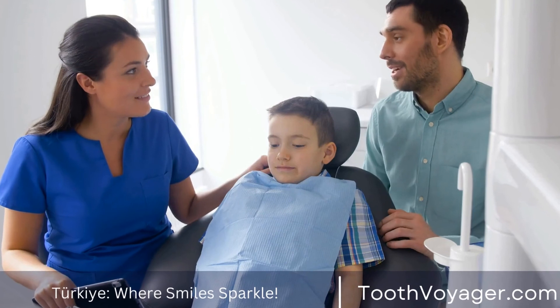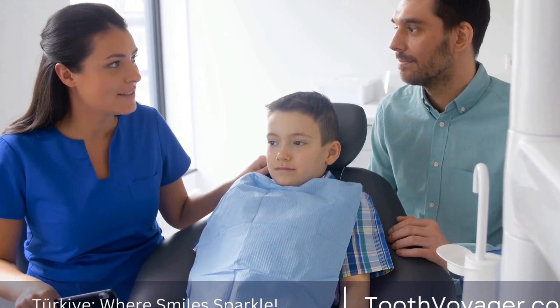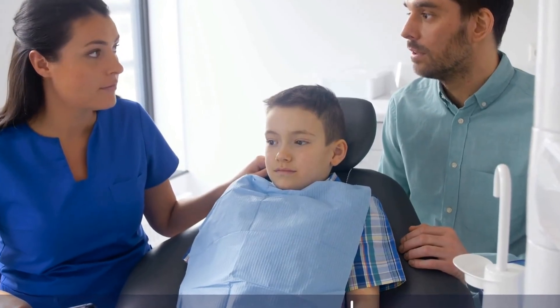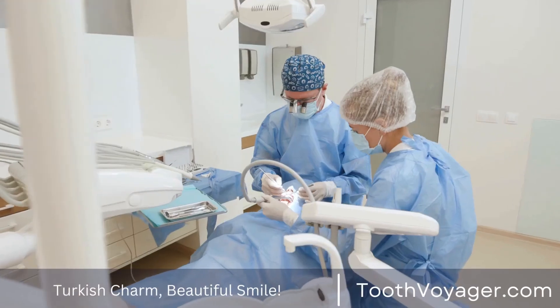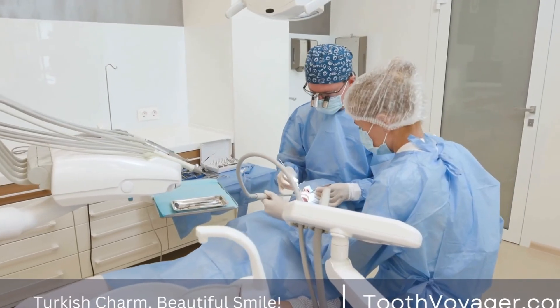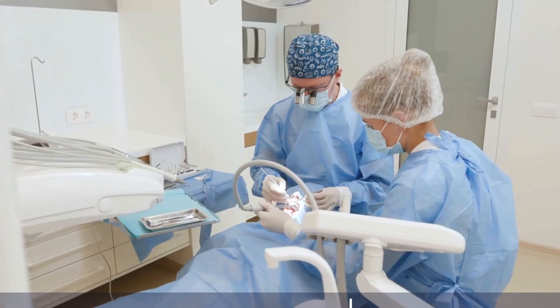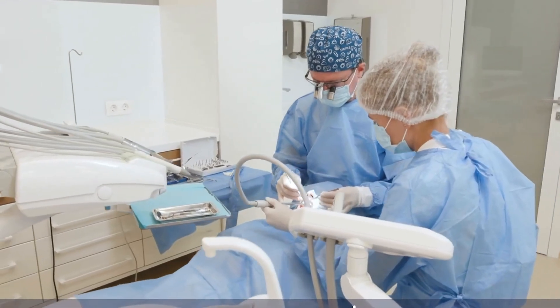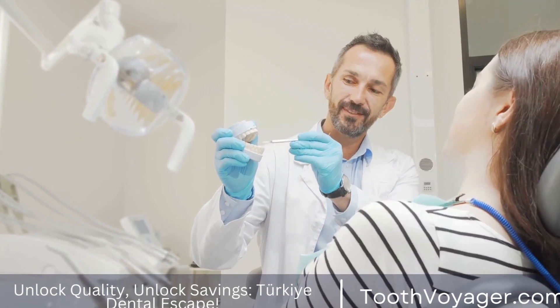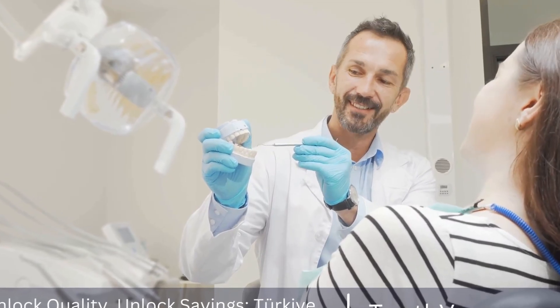In conclusion, there are various types of dental implants available to meet the diverse needs of patients seeking to restore their smiles and improve their oral health. Whether you are missing one tooth, several teeth, or all of your teeth, there is likely a dental implant option that can provide you with a long-lasting and natural-looking solution. It is essential to consult with a qualified dental professional to determine the best treatment plan for your individual circumstances and achieve the smile you desire.